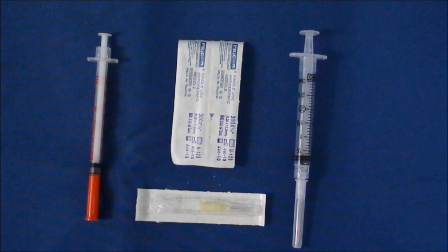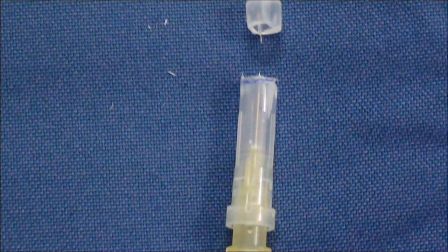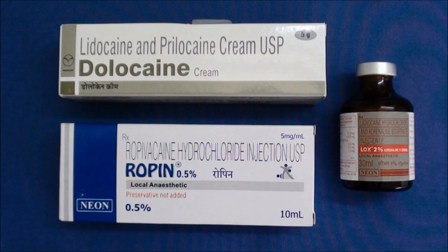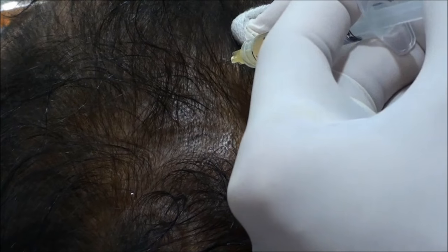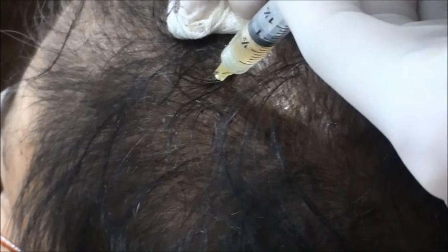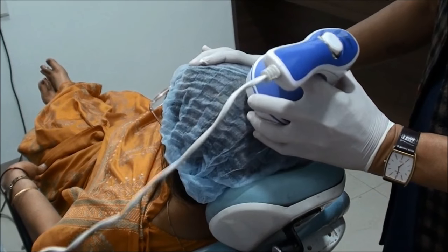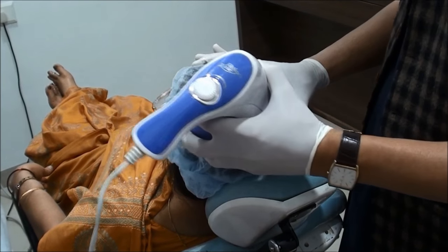You can use a guard for perfect depth infiltration. You can use local lignocaine in the PRP solution. 0.1 ml of PRP solution is injected per one square centimeter area. The total scalp area is 250 to 300 square centimeters, so 25 to 30 injections are needed. You can also use a vibrator.